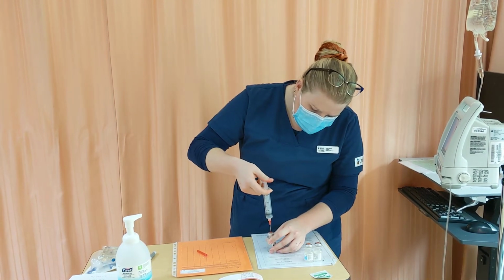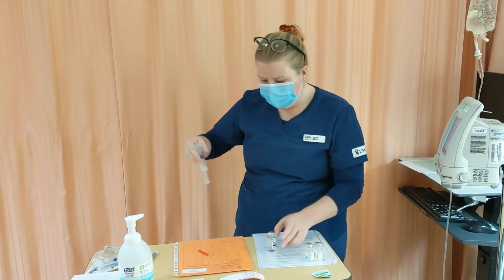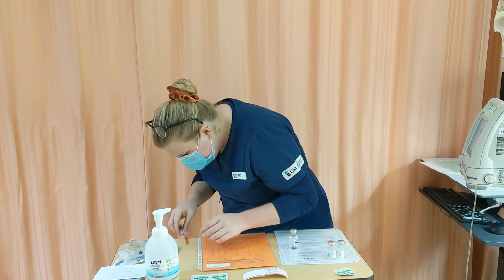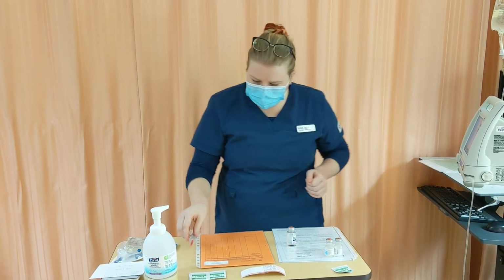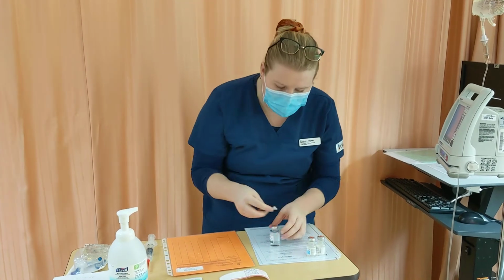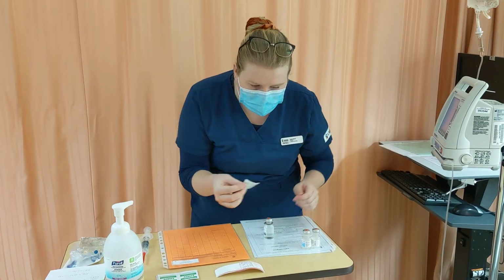Okay, so once I've reconstituted, go ahead and put that aside just so I can give my medication a quick rotation here, making sure it's all mixed. We don't have any sediment at the bottom. After I've done that, I'm going to swab the top again for 30 seconds just to make sure we're sticking with sterility here.